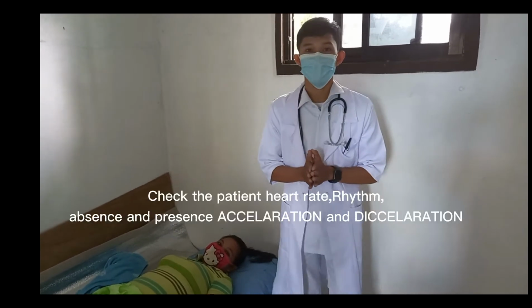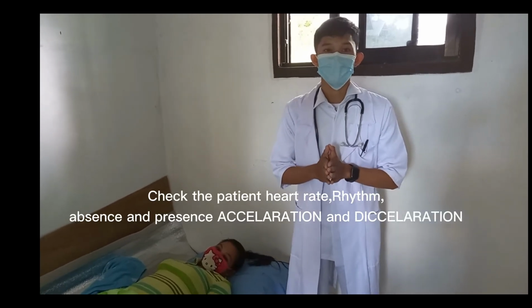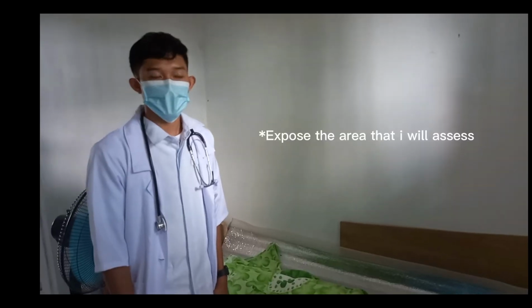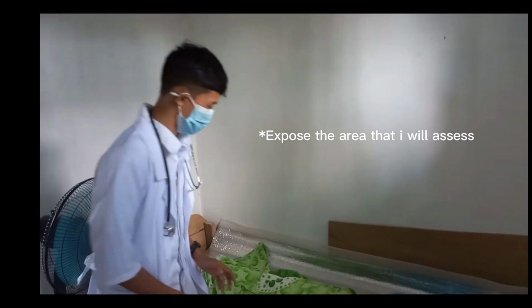So next, I will check the heart rate, rhythm, and the absence or presence of accelerations and decelerations. Next, I will expose the area that I will be assessing.